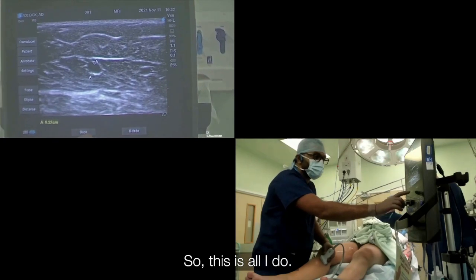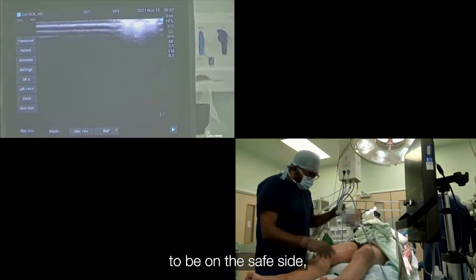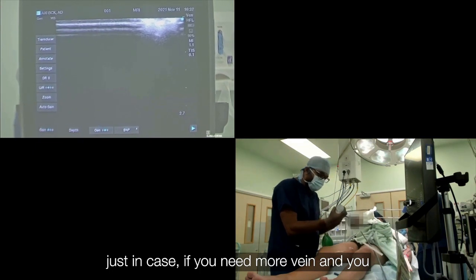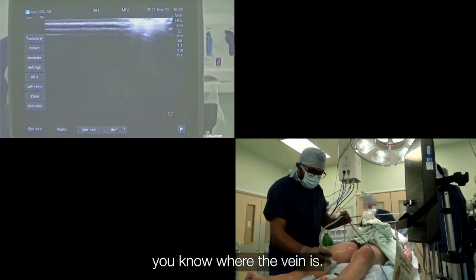So this is all I do. Now I know we have a decent vein on the right leg. Just to be on the safe side, I mark the other leg as well, just in case you need more vein and you have already started prepping and draping — the surgeon asks for more vein and you know where the vein is.